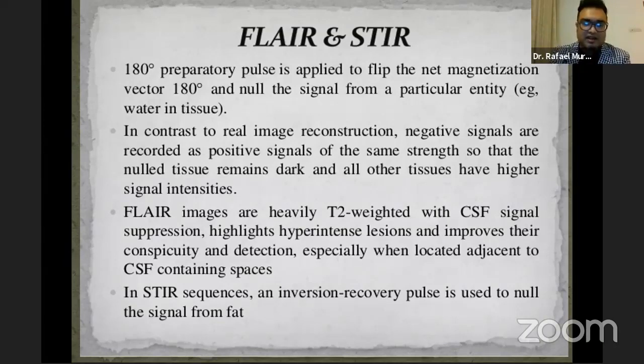In STIR sequences, an inversion recovery pulse is used to null the signal from fat. So next slide, please.